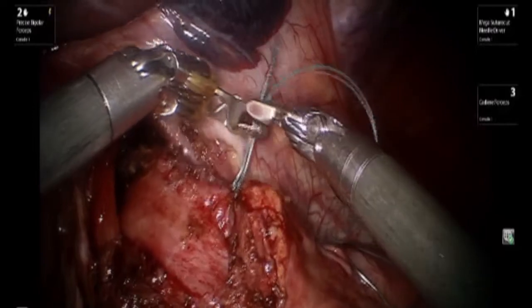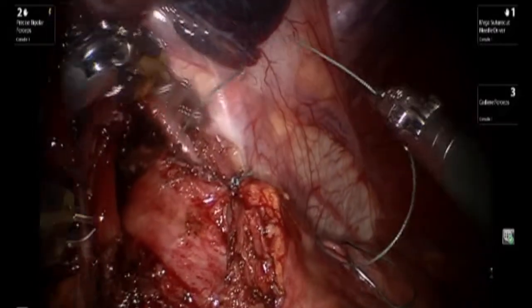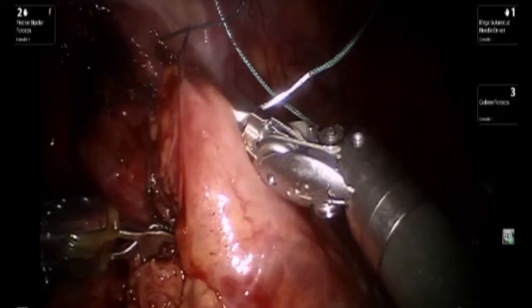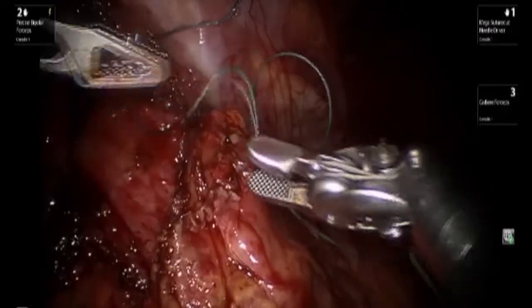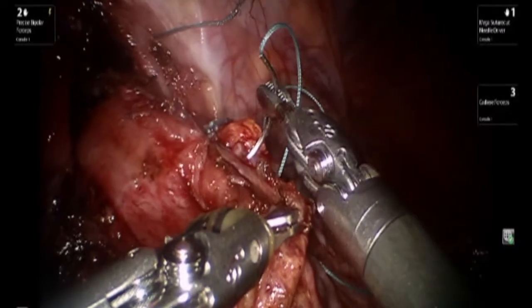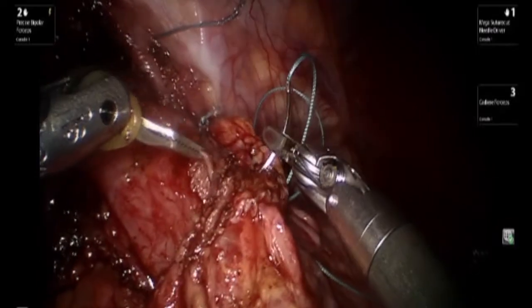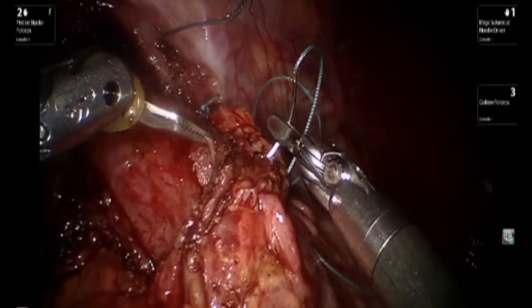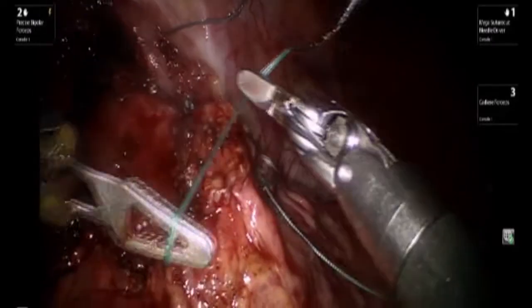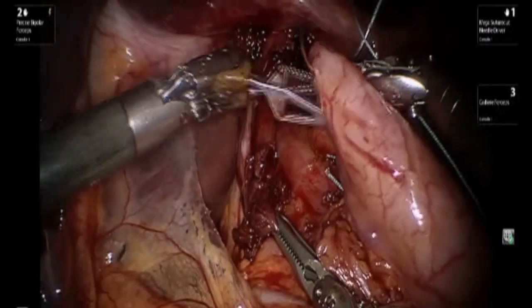The instrument utilized allows you to both cut and manipulate the needle. After performing multiple sutures on the left side, we proceed to perform the same type of flat sutures on the right side in order to essentially cover up the exposed mucosa.